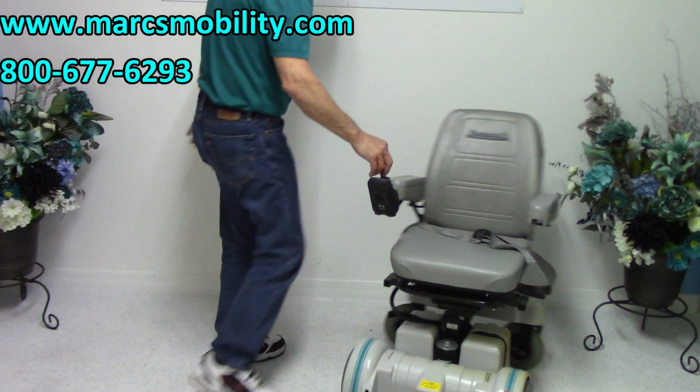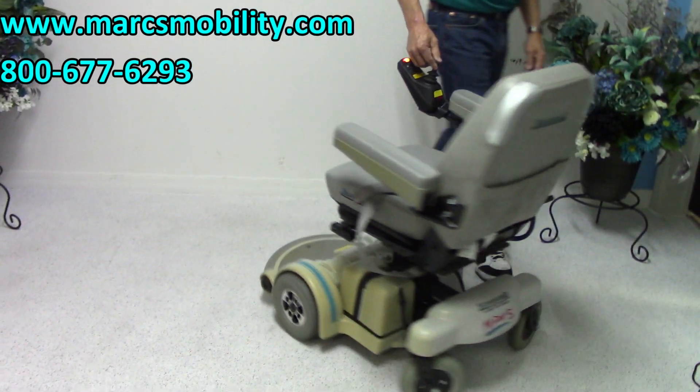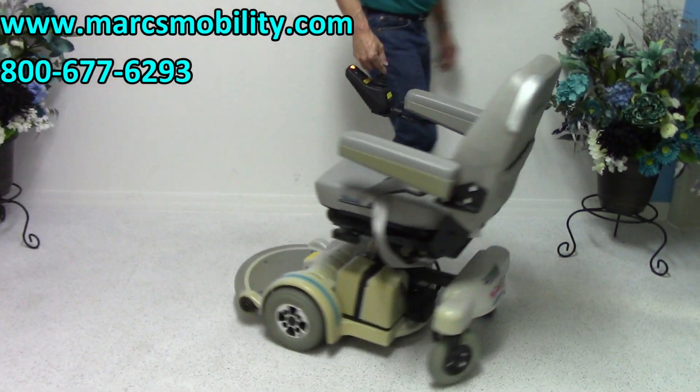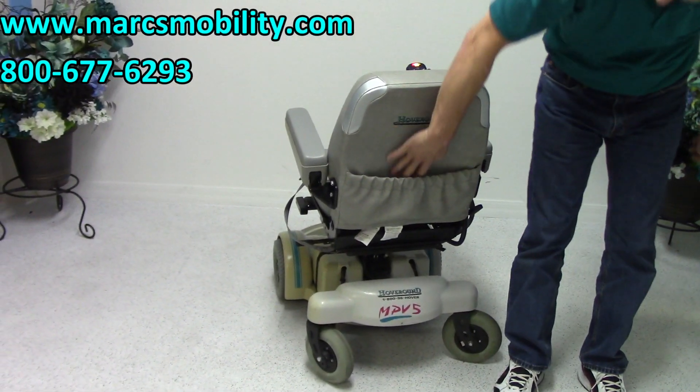The chair has a really nice turning circle — you can see it turning in a circle. In the back of the chair, we've got a nice pouch right here.